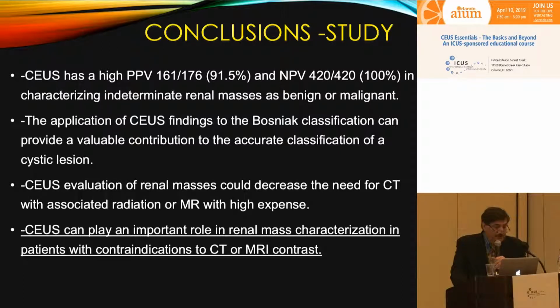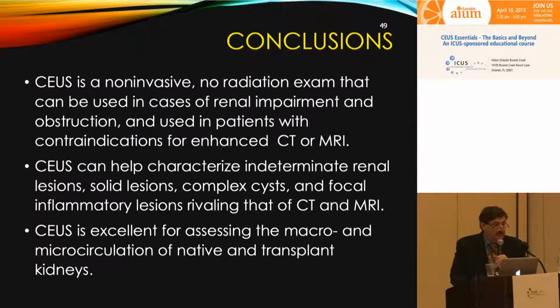So CEUS can play an important role in renal mass characterization in patients with contraindications to CT or MR. And I would say even if they can get contrast, we often have much better results, particularly in papillary cancers. And this is our general, yes, it's safe and everything else slide. Any questions?